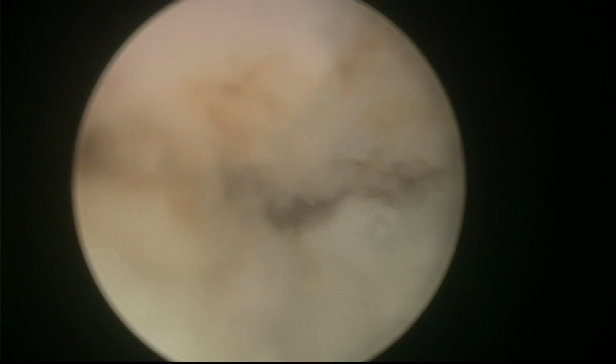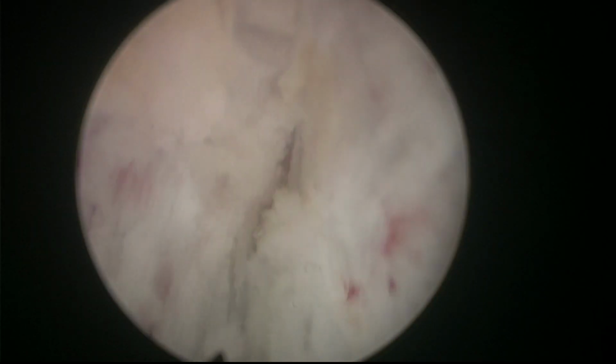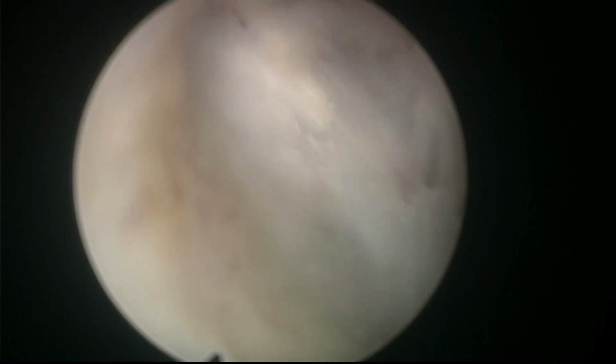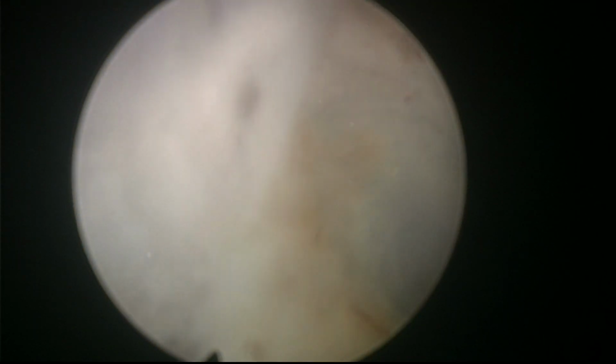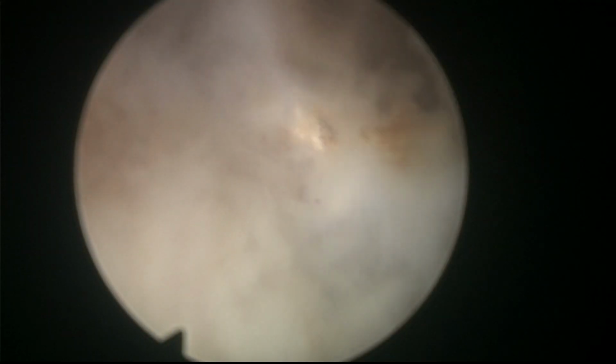And here, as I come anteriorly, I have to keep up as anterior as I can, and then as we get better access, sometimes there's a little bit of tissue that wants to remain there at 12 o'clock. If you see there is a little bit of tissue and you have already established a line that is more proximal than this tissue, you can leave it for the end. So you can continue with your dissection as long as you have connected with the right plane after the remaining tissue. I don't know if I can explain myself properly.